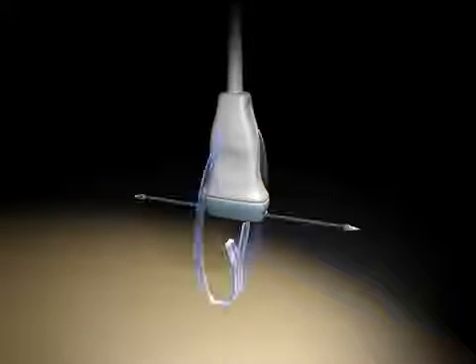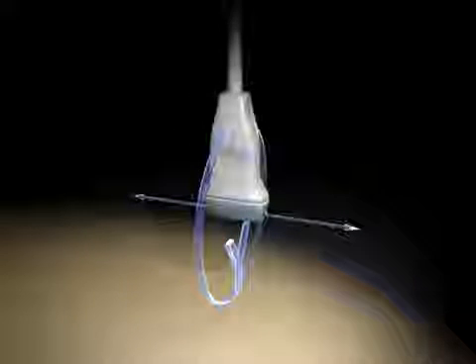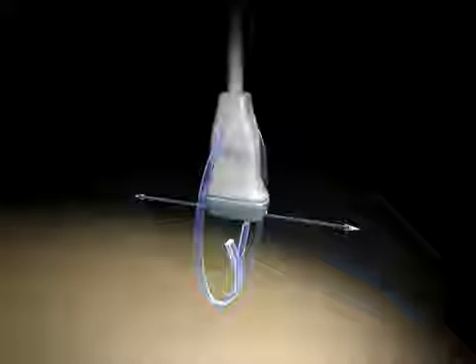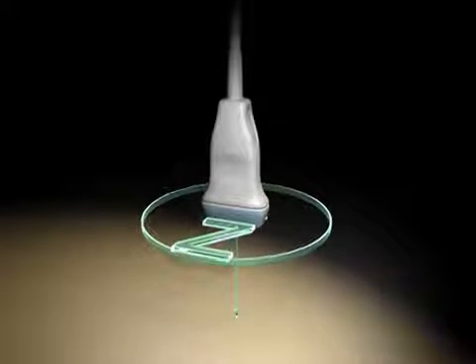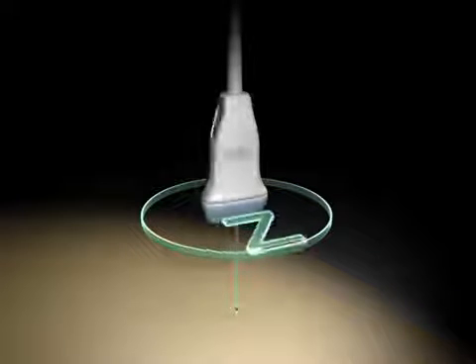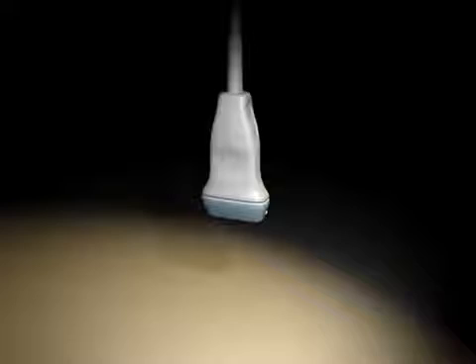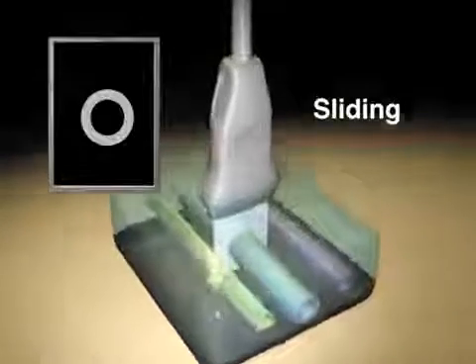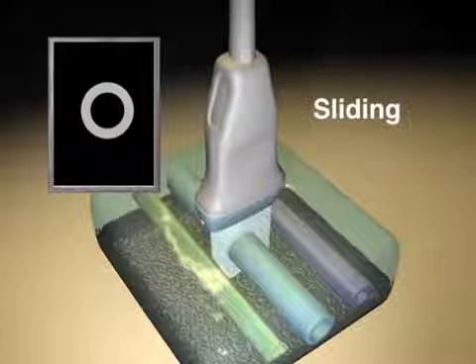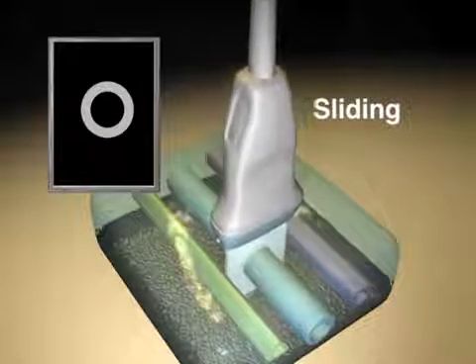Each of these movements has a name that we will define in the next section. Sliding is a maneuver that translates the transducer along the course of its structure, or perpendicular to it to scan adjacent structures.